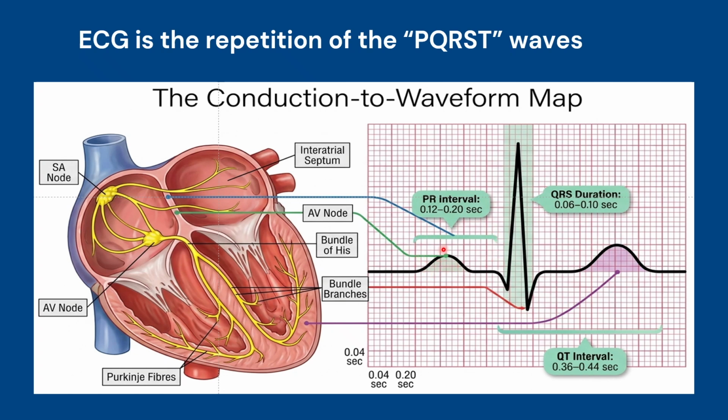which reflects the atrial depolarization and the conduction through the AV node and bundle of His. We also have the QT interval here, which involves all the ventricular stimulation and relief, which is the depolarization and repolarization. It means that the QT interval covers all the ventricular action potential.